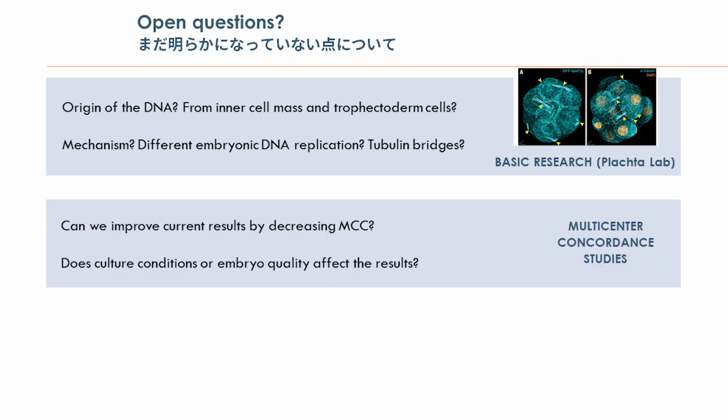And at the clinical level, we have done the study with a single IVF center. We need to replicate the results in different IVF centers to see if this is consistent and if this can be applied for clinical purposes. So for this, we are conducting a multi-center study in which we are doing the same study, comparing the results of the trophectoderm biopsy with the results of the media. In this study, we are also doing inner cell mass biopsy in some centers, because this multi-center study, you will see, is being performed in different countries. In some of them, research with embryos is allowed. In other countries, no.